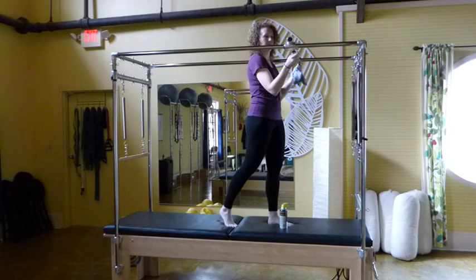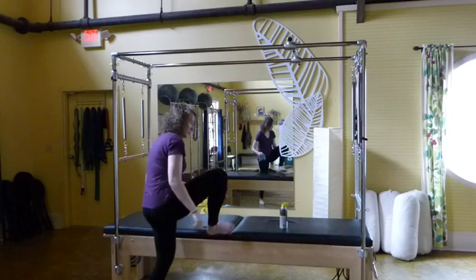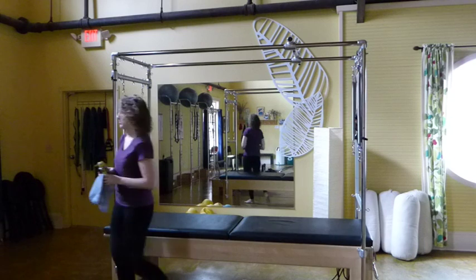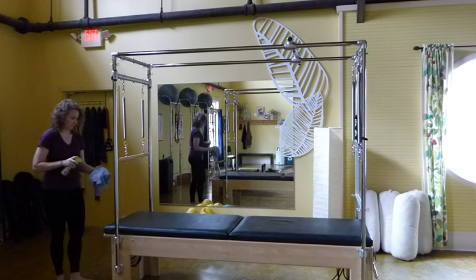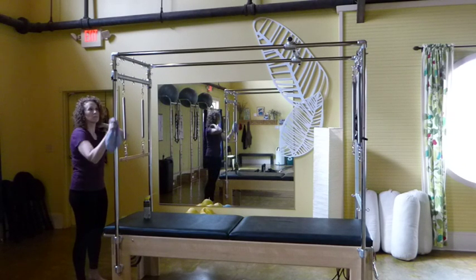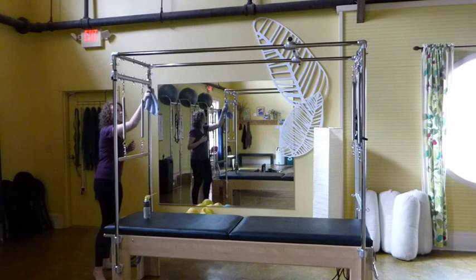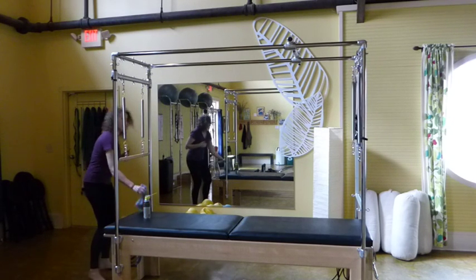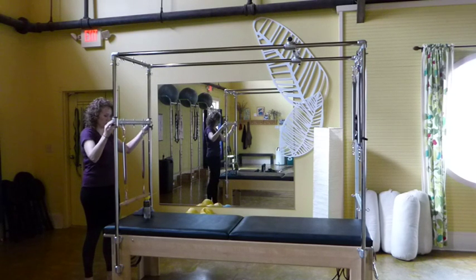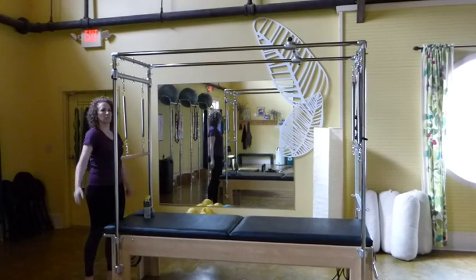Okay. Let's do the same thing for the vertical slider. Great.